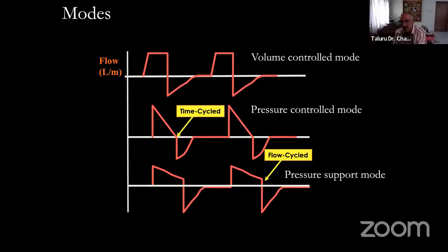But unfortunately, the ventilator companies call that rise time. So don't confuse. Whatever they call, we are only increasing the peak flow, opening the tap for more. Because from 2 seconds, I have made my time for waiting to fill up 1 liter in my bucket to 1 second, then I have to open the tap much faster. The flow has to increase. That is the basic idea of understanding the expiratory trigger sensitivity and the rise time. It is not rocket science.